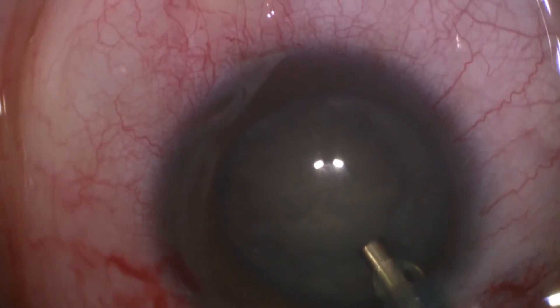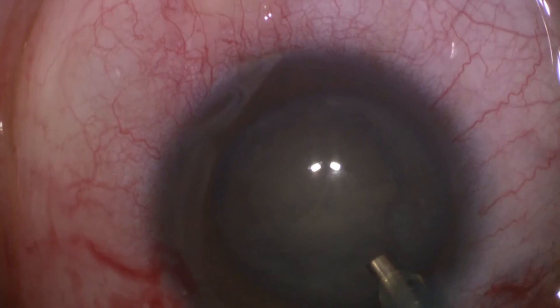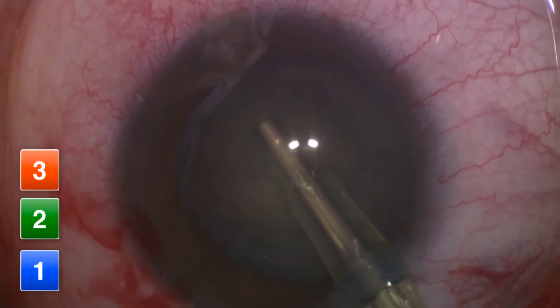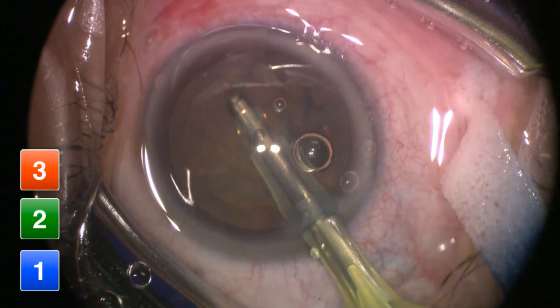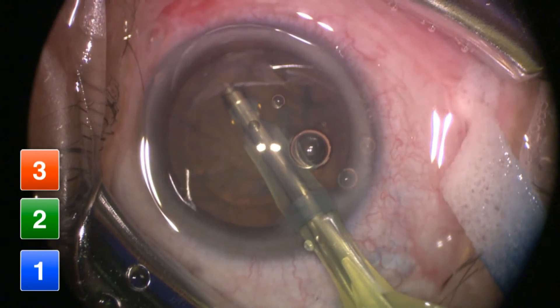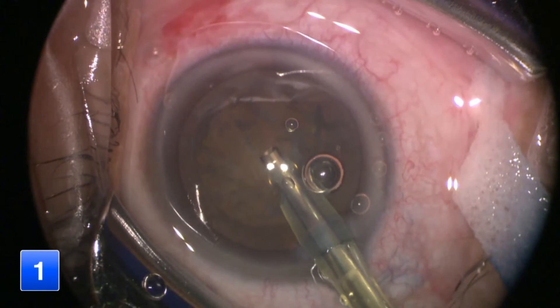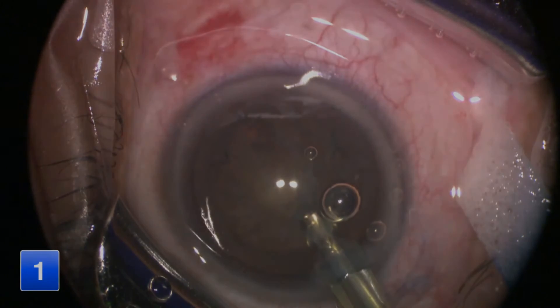As you are stroking from one side to another, imagine yourself at the starting point of a race. Press the foot pedal to the maximum level as you are creating your stroke. By the time you reach the other edge of the rhexis and are getting ready for another stroke, go back to irrigation while repositioning your FACO probe, as you won't be needing aspiration or ultrasound during this period.